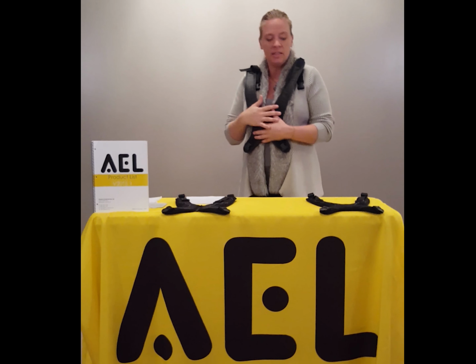If you do not want your client to have that capability, the non-stretch option is going to be the better route. Now, specifically, there are some diagnoses in which tone is present. Okay, so if you have a diagnosis where tone is present, so there is hypertonicity, there are writhing motions, there are spastic or high tension motions that are occurring.